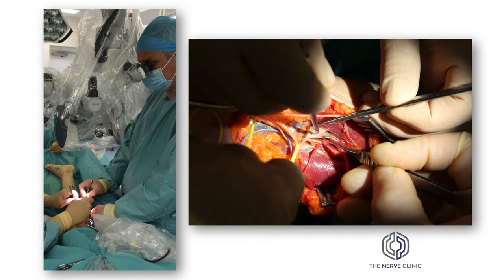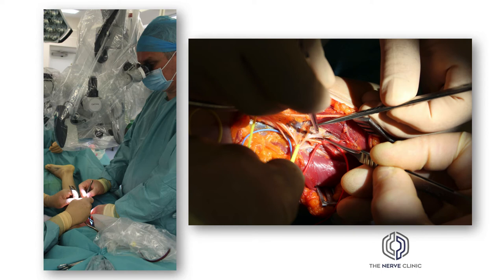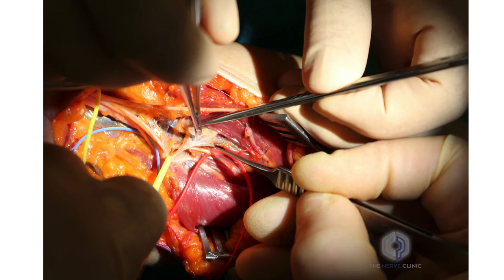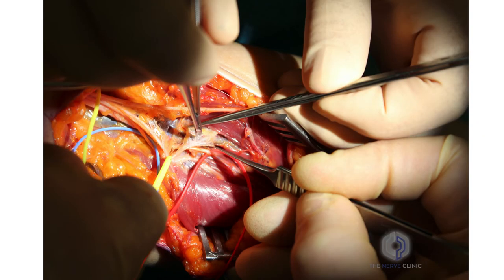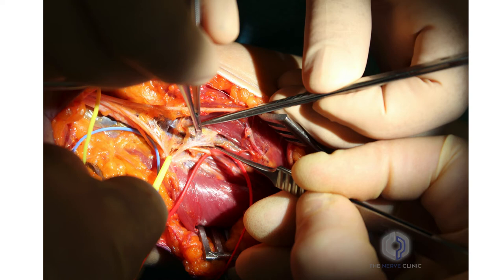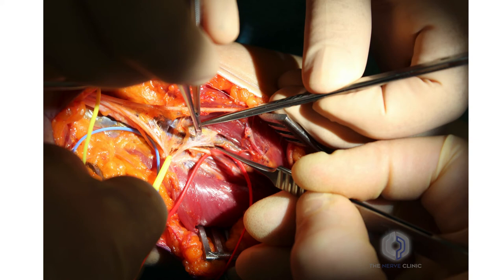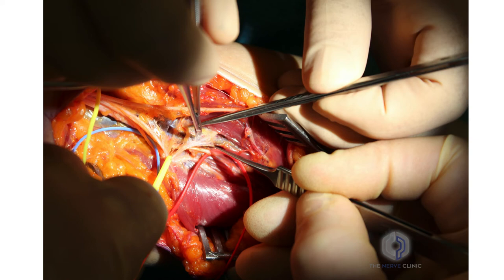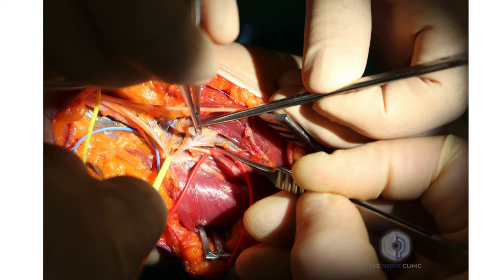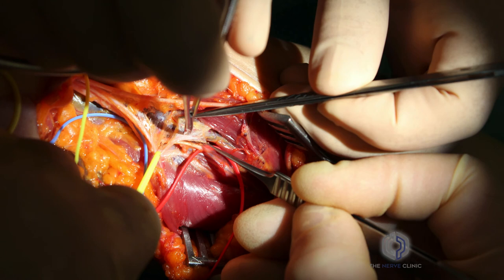Because the neurectomy is undertaken on the motor components of the peripheral nerve, pain does not normally follow. Under high magnification it is possible to see the individual fascicles entering the muscle; these are carefully mobilised so that at least 50% of them can be sectioned. Normally a piece of the individual nerve is removed rather than simple sectioning, to try and prevent further sprouting, regrowth, re-innervation and return of spasticity.